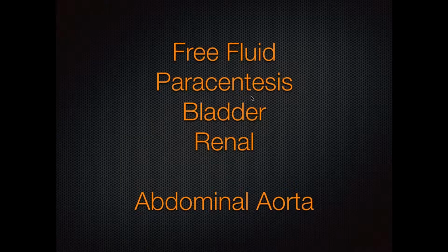We talked about the utility of using ultrasound to guide your paracentesis procedures. Despite being trained in a blind fashion, very uncommonly would I proceed with a paracentesis without having looked at the abdomen and the ascites itself with ultrasound. We've also talked about bladder scanning, sorting out the volume of the bladder, what hydronephrosis would look like on the renal scans, and touched very briefly on some of the techniques for evaluating the abdominal aorta.